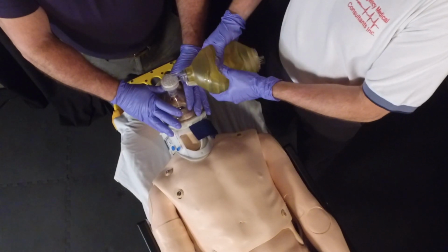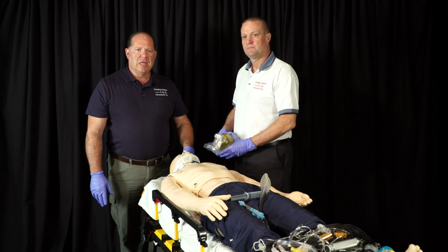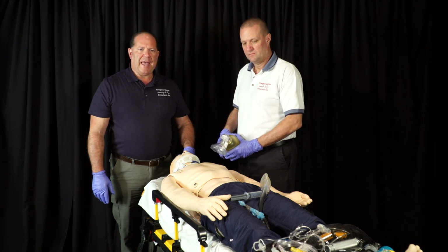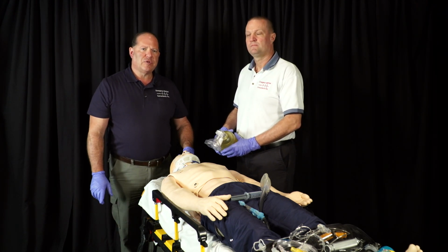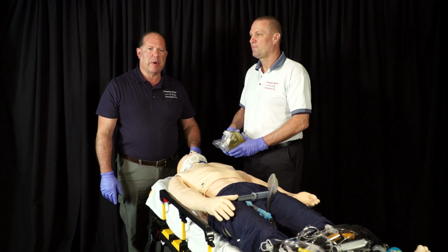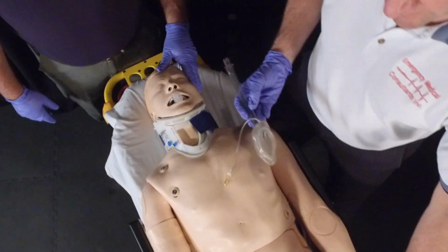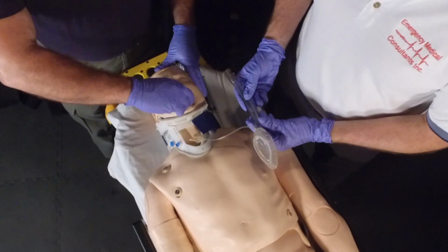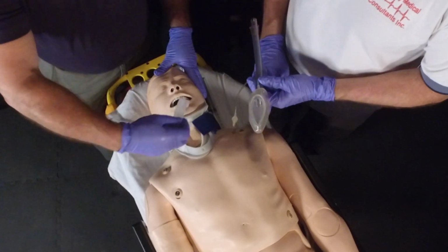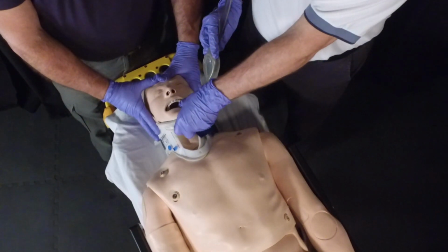Several different supraglottic airway devices can be used instead of intubation. These devices don't require you to move the head very much and are very quick and generally ventilate well in patients who don't have too many complications, such as requiring higher airway pressure or having a lot of blood or vomit in the airway. Let's look at a couple of those. The laryngeal mask airway is basically sized based on the patient's weight, and once the patient has been oxygenated and ventilated appropriately, it can be put in the neutral position and slid down to the posterior pharynx and inflated very quickly.